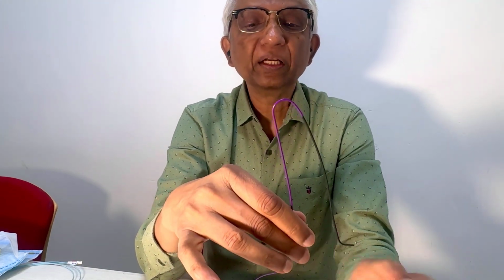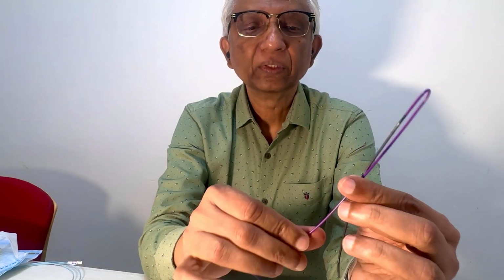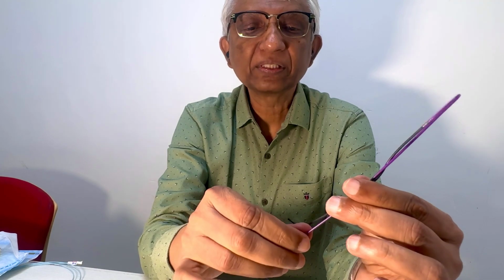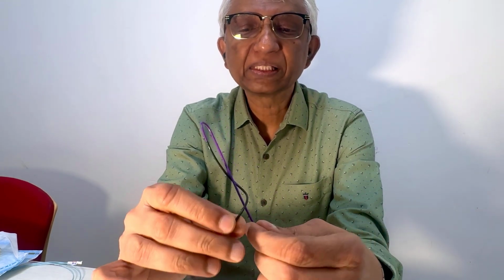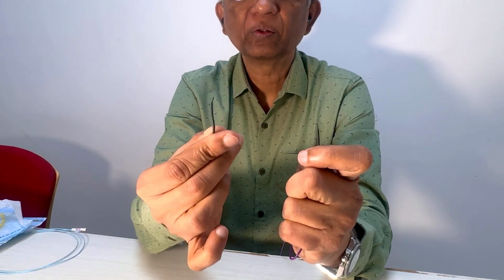Also remember, you can easily knot this catheter. So you can understand, as you target, it gets knotted. And the most dangerous part of this catheter is not just the knotting. The problem is this catheter can break when you knot. So be careful. See, look at this catheter tip. Keep looking. Can you see that? It's broken into 2 pieces. It is as flimsy as this.